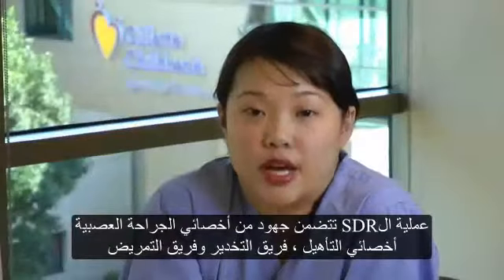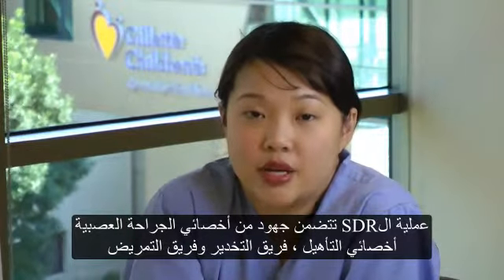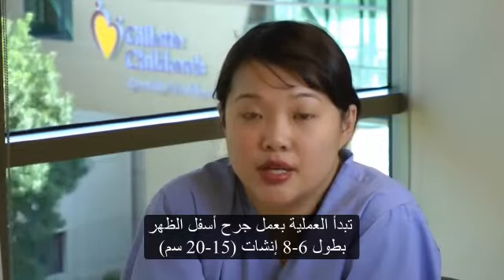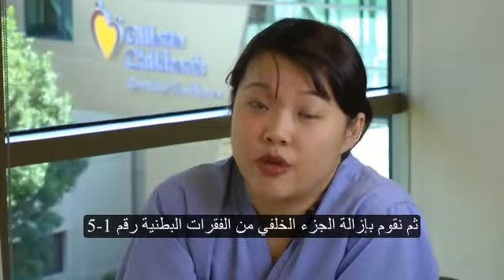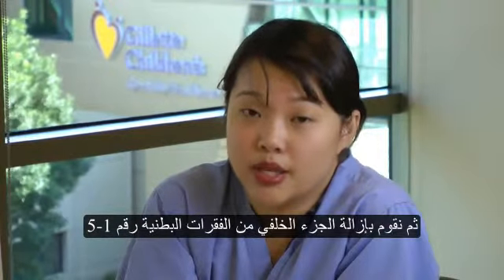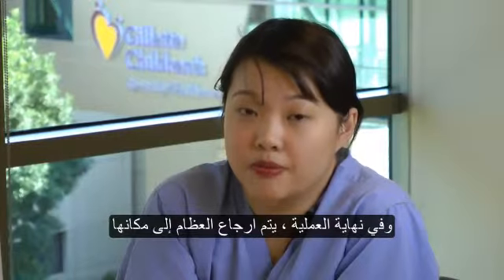A selective dorsal rhizotomy involves the coordinated efforts of the neurosurgery, physiatry, anesthesia, and nursing teams. The operation entails making an incision in the lower back that is approximately 6 to 8 inches long. We perform what we call a laminoplasty, in which we remove the back part of the spinal elements from the lumbar 1 or L1 to L5 levels. At the end of the procedure, the bone is put back on.